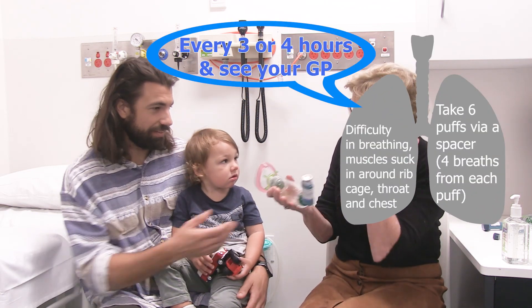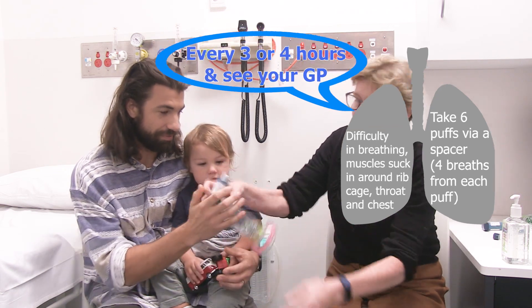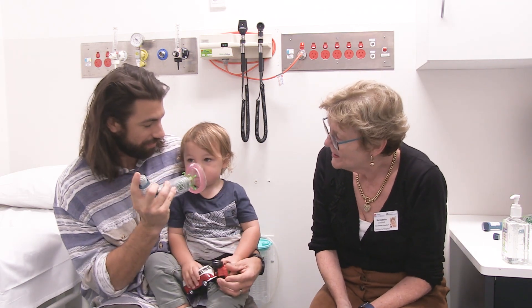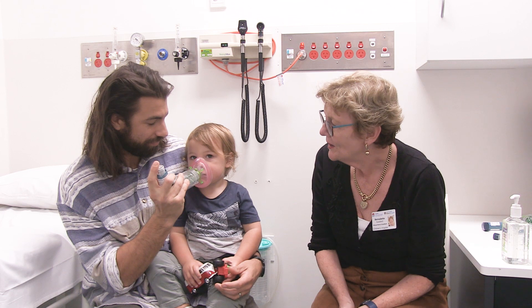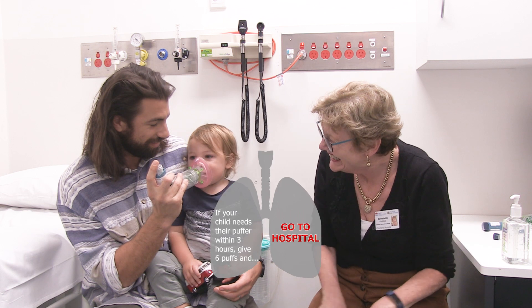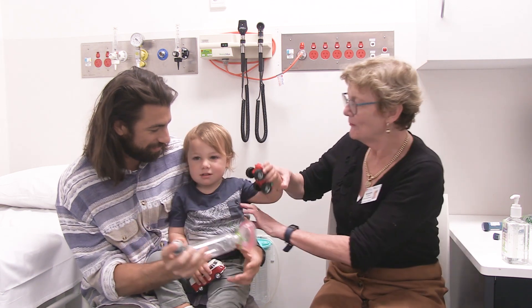Do you want to give him one? Yeah, I'll give it a go. Give it a shake in there if you like. One, two, three, one more. Tickly under there! Well done!